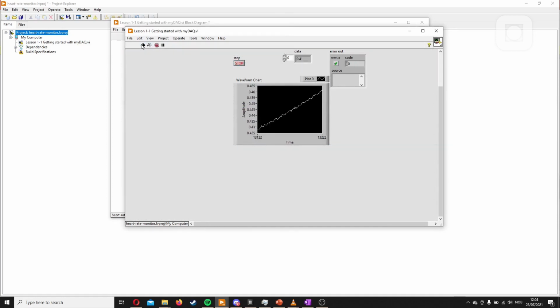And now I'll have a flashlight going over it, and you'll see it reacts. So I have just a basic circuit. It's not ready to read the heart rate yet, but it's ready to just take up signals, and as you see, it gives us feedback. If you don't get this, and you don't get any error, you just get some noise, I would suggest that you check you have connected the circuit correctly and to the correct input. Remember, we are using the analog input 0, so double check that on your board.